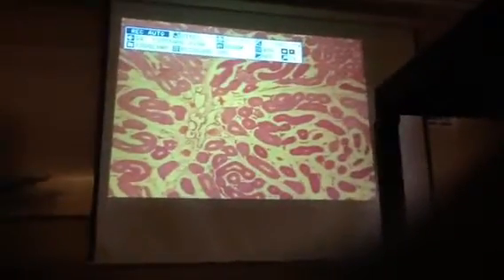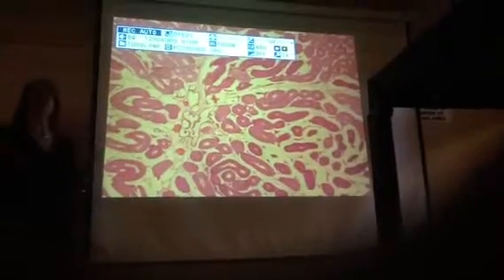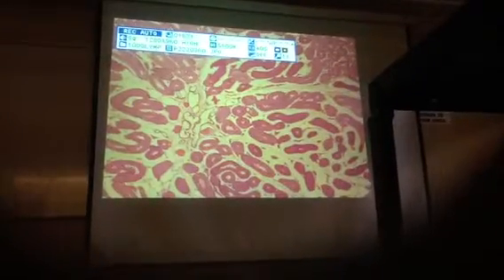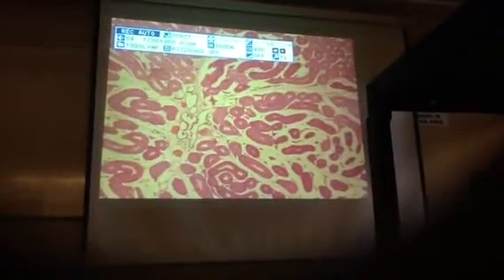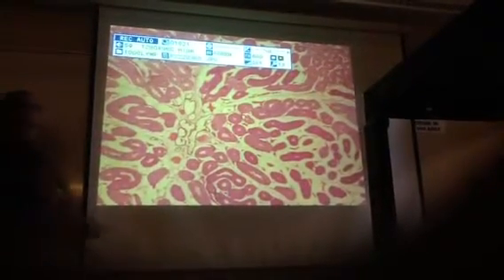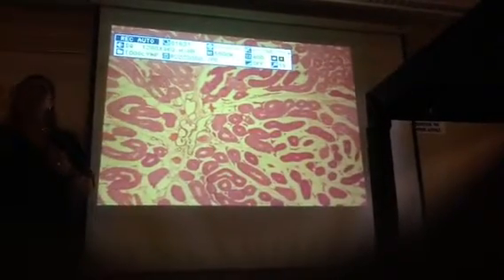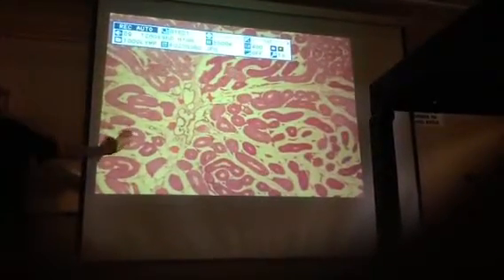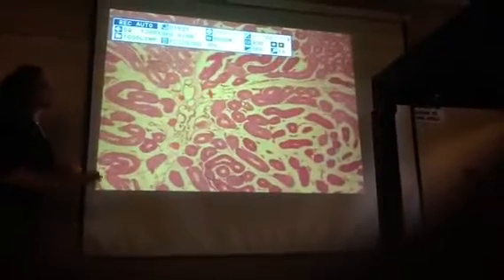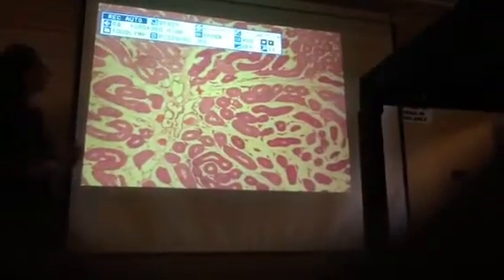That you're going to have to do for histology: tell the two apart. And it's not even that difficult, but it is a little bit more challenging. So what we have up here is the testes. And remember, the testes has seminiferous tubules that are tightly coiled. So when we cross-section the testes, what you're seeing is all these little tubes, cross-sections of these tubes.